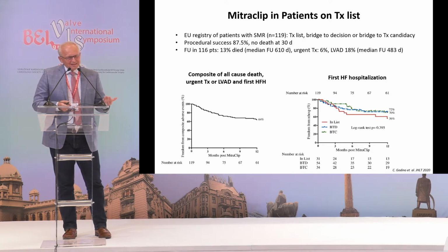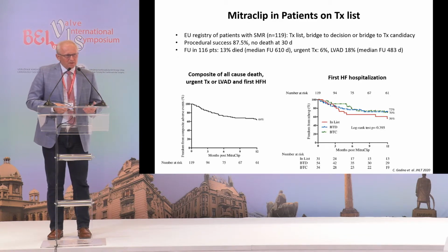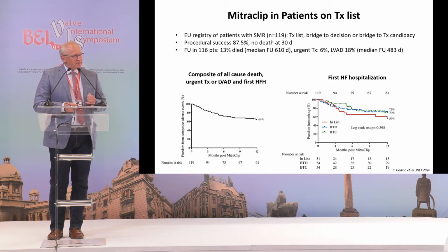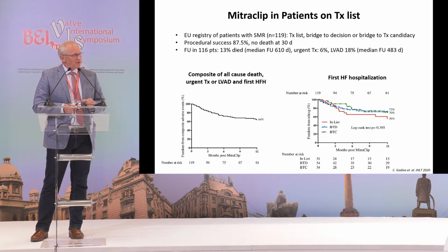So basically saying that there are no randomized data. It's very hard to get them, but we should not dismiss these options, even for those patients who don't truly qualify always for the COAPT criteria from the clinical perspective.